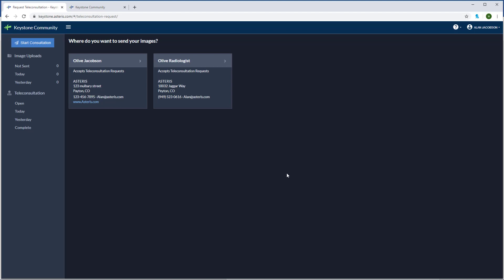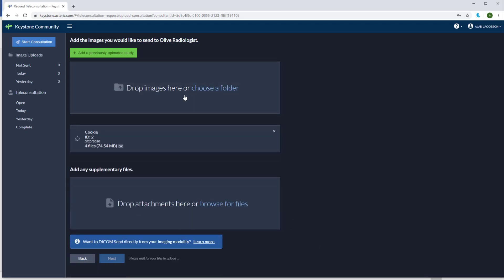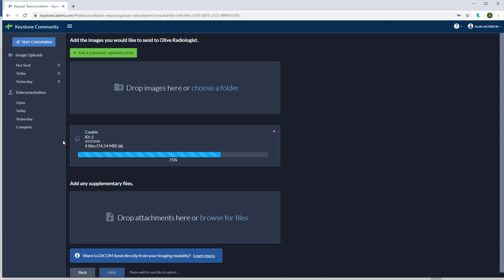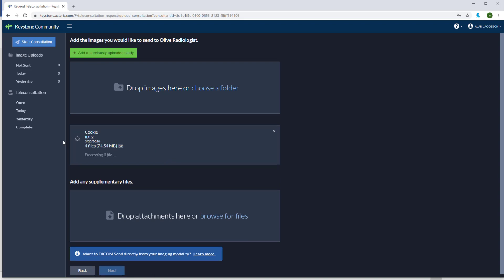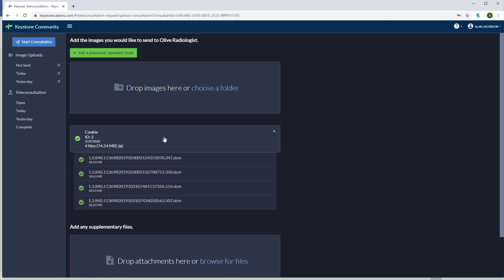If you're not planning on using the DICOM service, the start consultation tab will bring you to this menu with all of your preferred consultants. Simply click the desired consultant. From here we can simply drag and drop the images into the image section. I've already exported the images from my x-ray unit in DICOM format. I've also put them in a folder on my desktop. Simply drag and drop the folder into the image section. Now you can see cookie's x-rays are uploading. And we have four images. I can click here and see that they've all been uploaded in DICOM format.